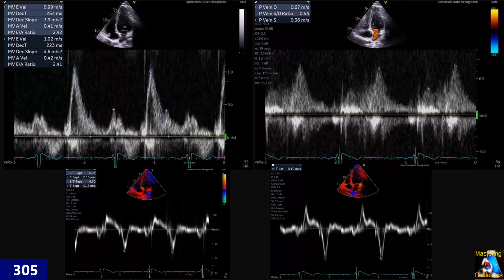Here we have the diastolic parameters — the answer to this question. What is the problem with this patient? What was the source of that murmur that we even noticed on auscultation? And second, what does this pattern show you? Why here we have pulmonary vein S smaller than D — S and D are reversed. And here E to A is greater than 2, specifically 2.4. And here we have medial and lateral E prime. Can you explain why we have this pattern and how we can differentiate this from severe or restrictive diastolic dysfunction?